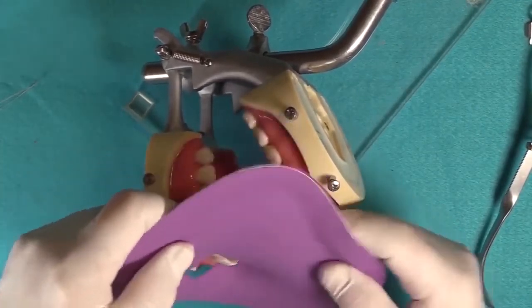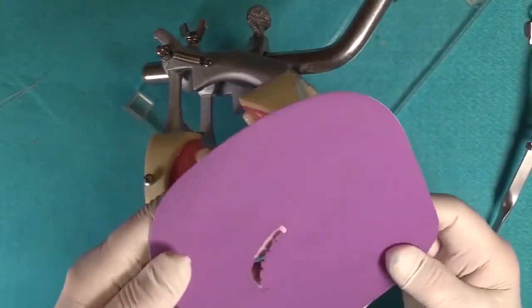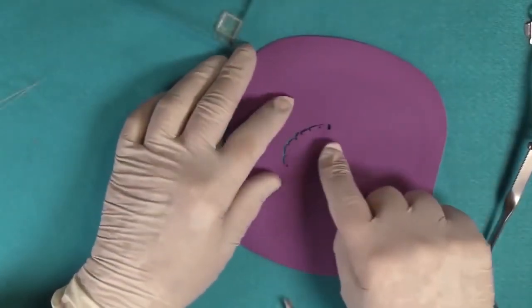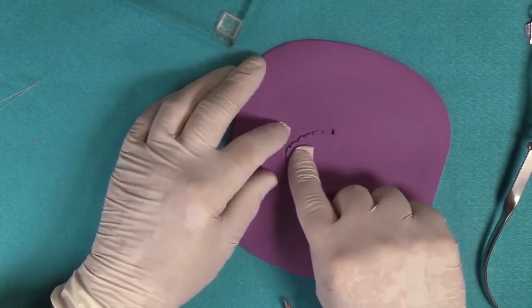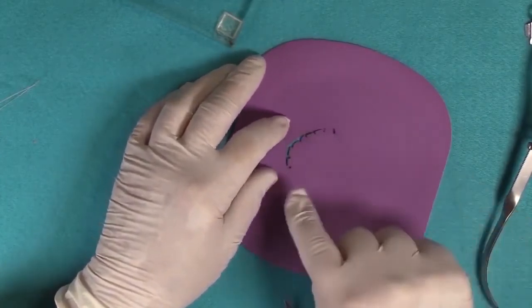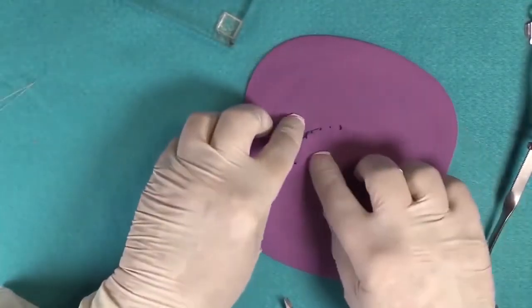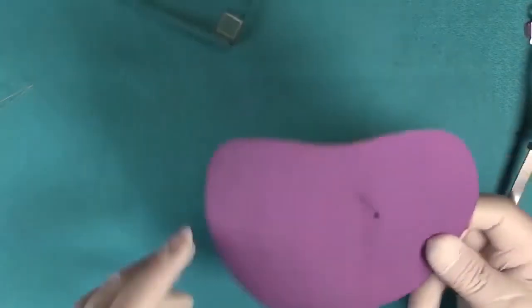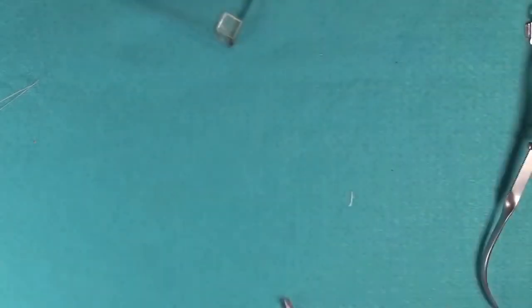Now your dam and frame come off together. And then it's very important that you check for missing pieces. So what you want to see are the holes that you punched and the slits that you made to remove it. If there's any missing piece, you need to go back with dental floss, retrieve it, and match it up. Make sure that you have all the pieces. And that is how you would do a traditional dental dam placement using the wing technique.